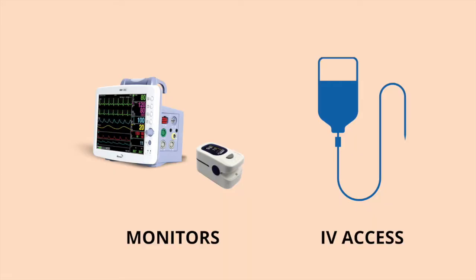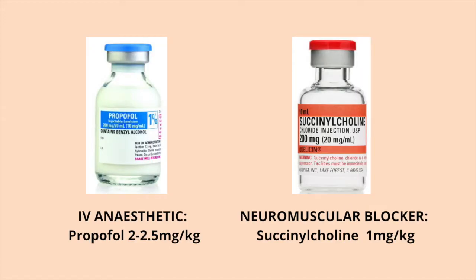After which, you hook the patient to cardiac and pulse oximeter monitors, then maintain IV access for medications. Since the patient is hemodynamically stable and with no contraindications as stated by the case, we administer propofol and succinylcholine with the following dosage you can see from the screen.